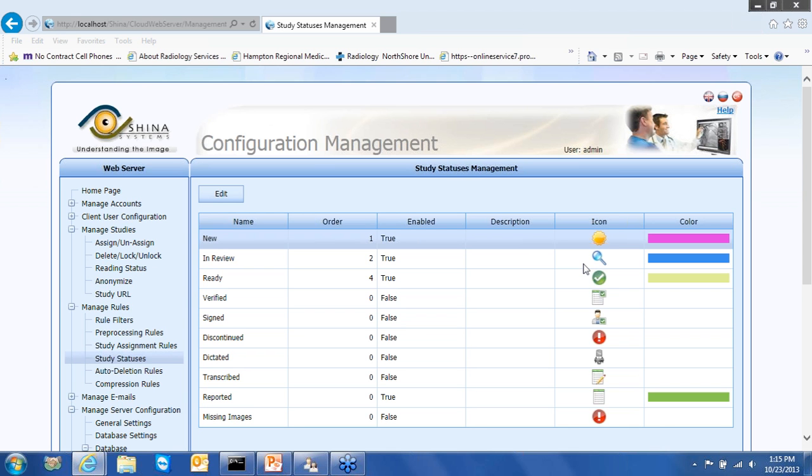Once it is set and configured by the site's needs and requirements, there is no need to reset it again, no need for an IT person to manually set those frequently used rules. And we can set them by an advanced mechanism that allows us to separate them into different groups, different types of users, etc.